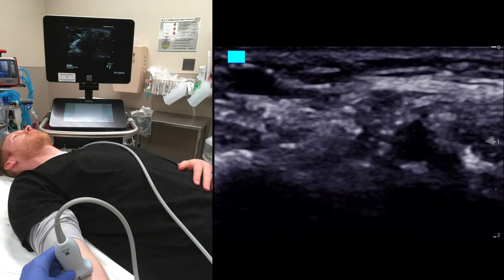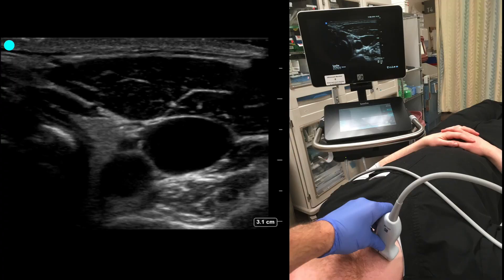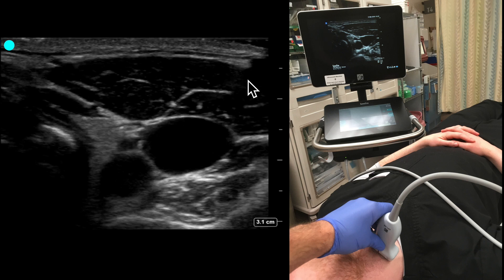Say we're going to do an IJ and we're looking at the patient's right IJ. The probe marker is actually directed this way because my indicator is over towards the patient's left. That's important so that when I look at this right IJ — here's the artery, and here's the vein — I know which way to move my needle when I see it sonographically, so I'm not accidentally redirecting and hitting the carotid thinking I hit the IJ, or injuring another vessel, or going towards the esophagus or trachea.